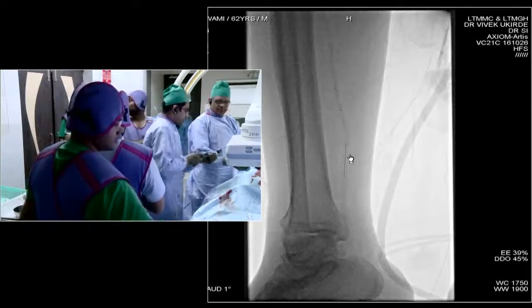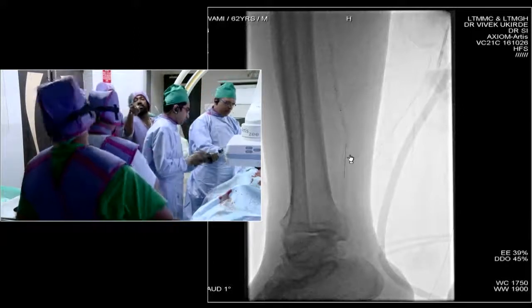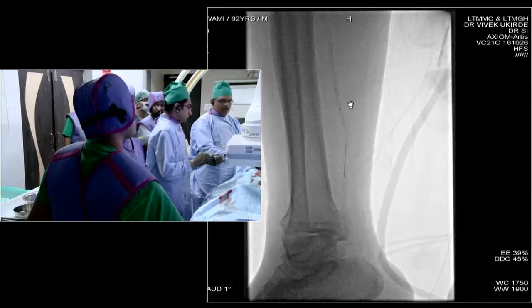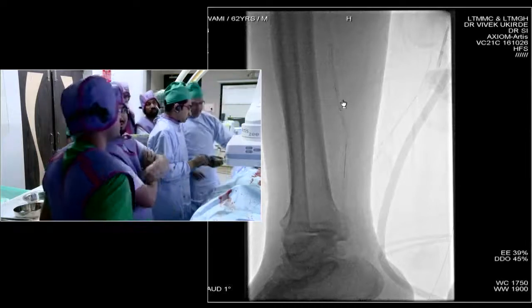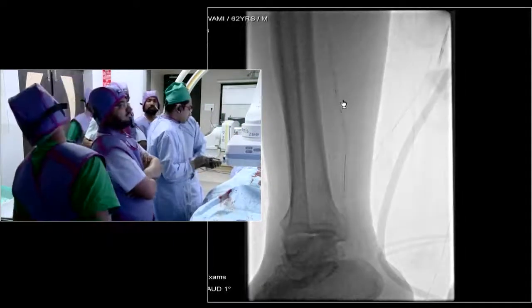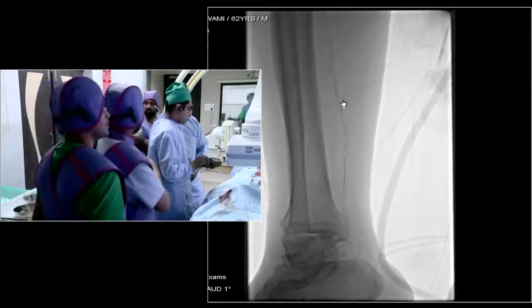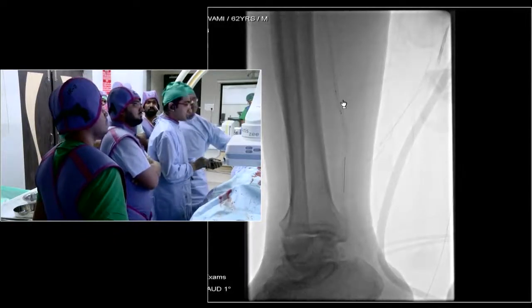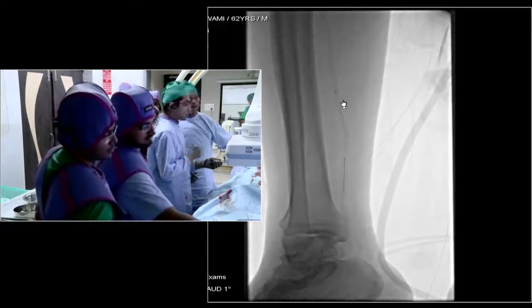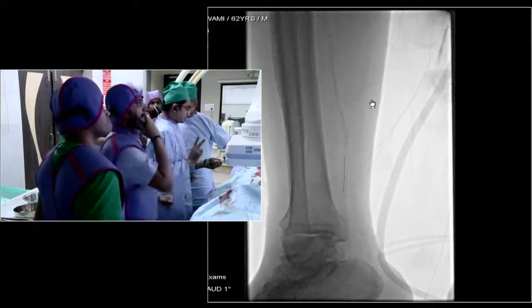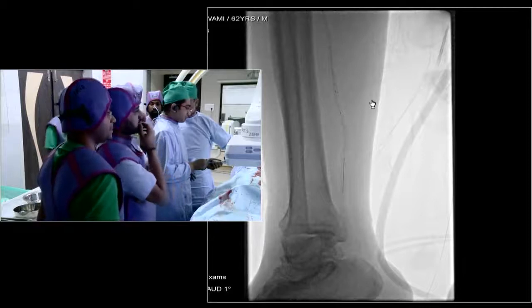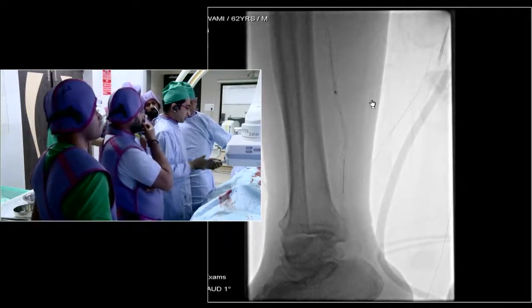We are inflating the scaffold balloon — this is 2.75 by 19. We go slowly: one, then two atmospheres, so you slowly inflate the balloon. We are at four now, waiting 10 seconds, then going to five.